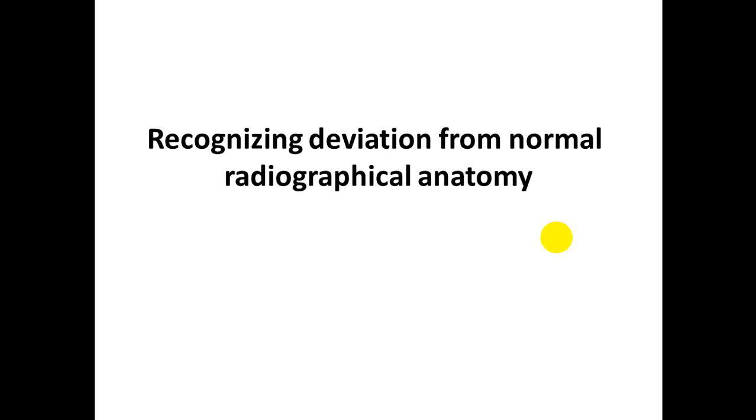Common radiographic observations. Thus, the dental hygienist and dental assistant should be able to identify radiographically include the appearance of restorative materials, developmental anomalies, periapical pathology, and other pathological conditions, and also the effects of trauma. وراح تجي ناخذها عندنا هسه المواضيع بالتدرج.